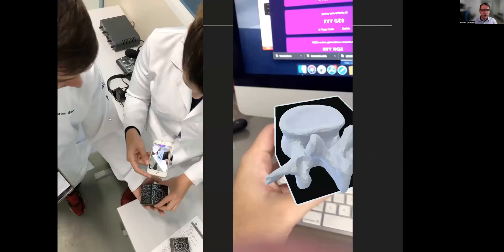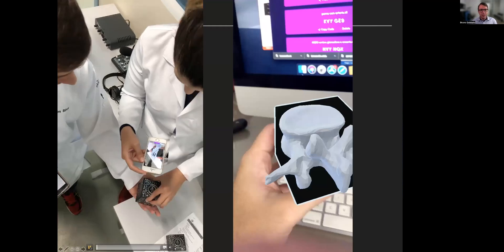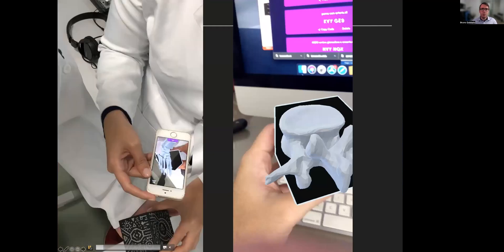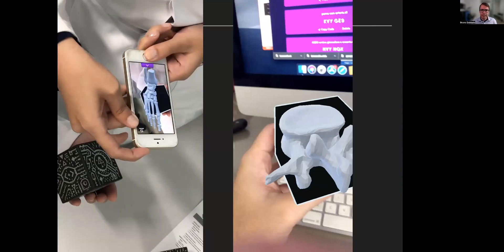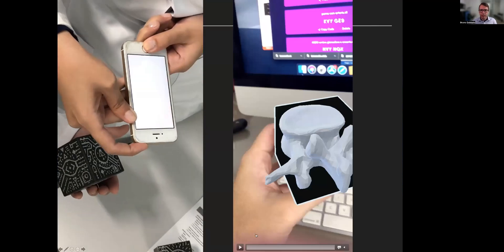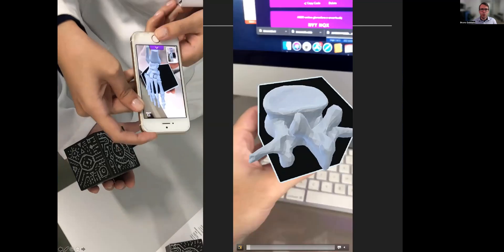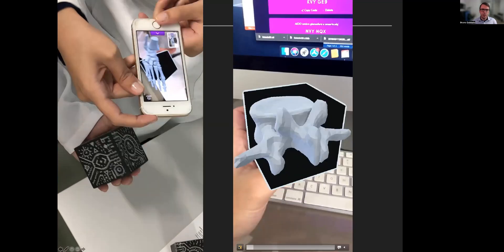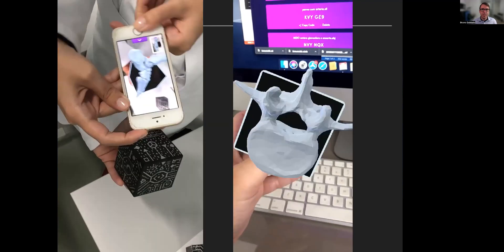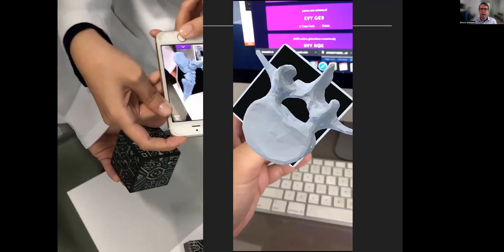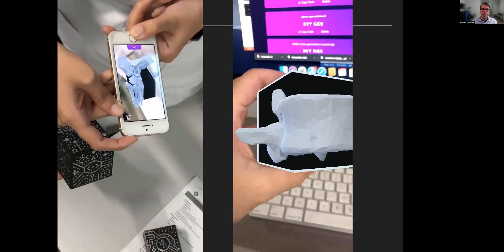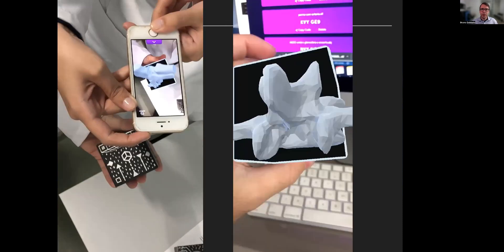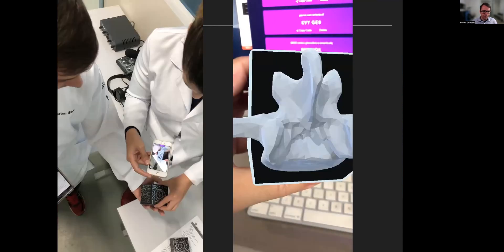This is an example of how we are using this technology for our medical students. These are 3D models — real life 3D models from patients, from CT scans — and we can use them to teach anatomy. The students can use and see 3D anatomy in their own hands, and for free. This app is free; you just need to upload your models.